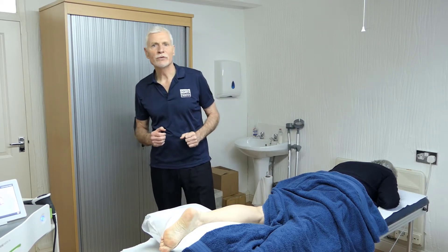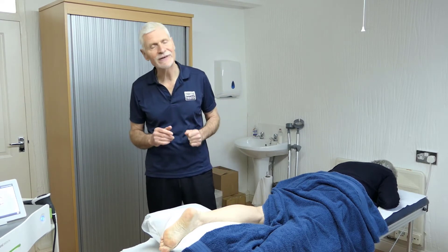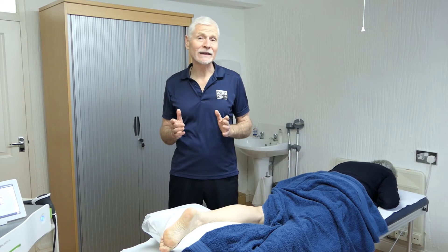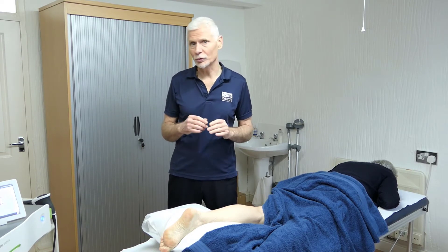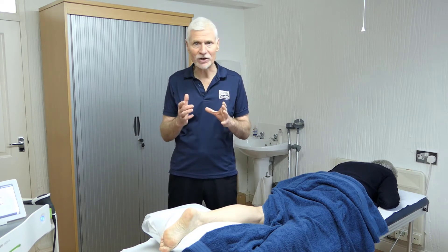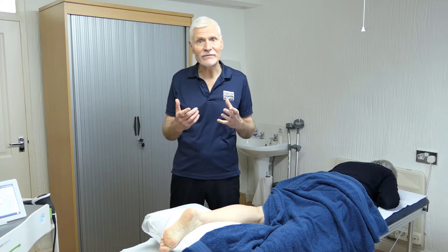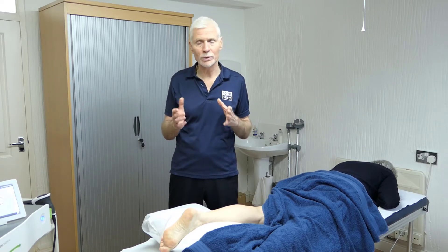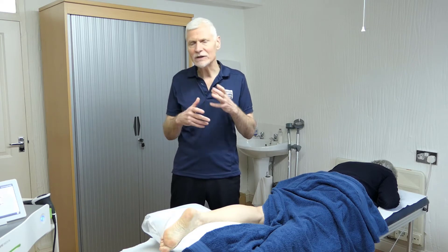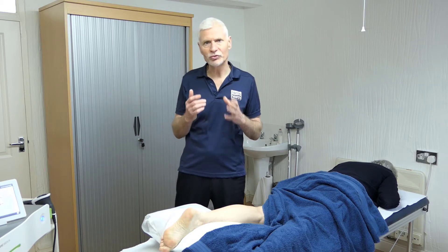I'm going to use an example of using shockwave therapy for tendinopathy. In this case, it's an Achilles tendinopathy. Shockwave therapy, or more accurately extracorporeal shockwave, produces an acoustic wave — a sound wave of energy — which goes into the body and then has several physiological effects. What we're doing here is using it to change the healing mechanism of the body and also to reduce pain.